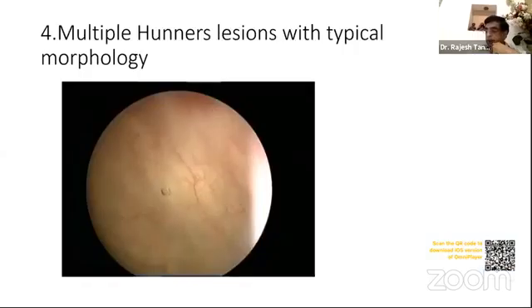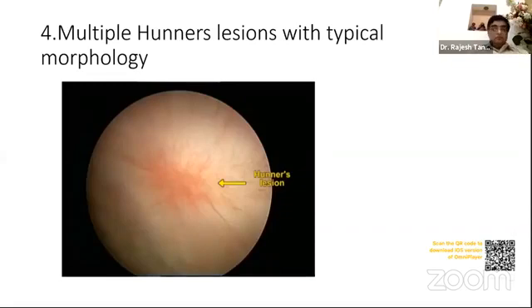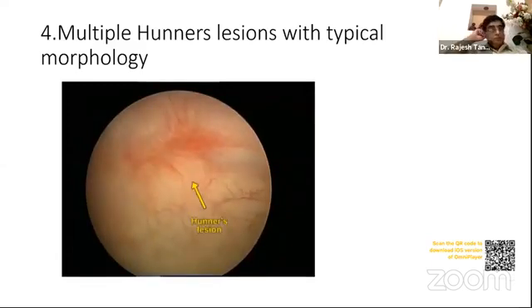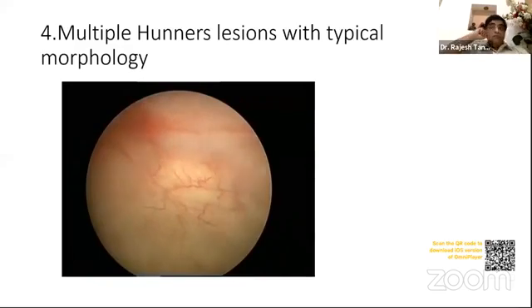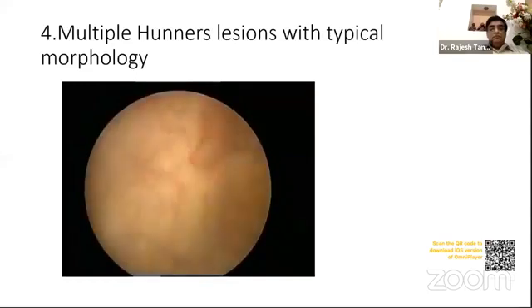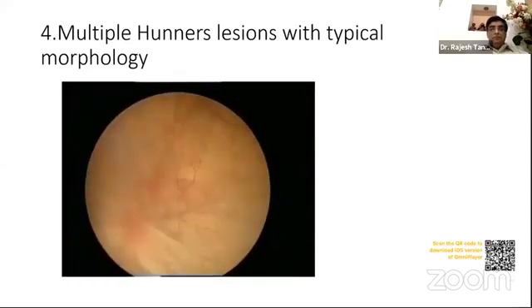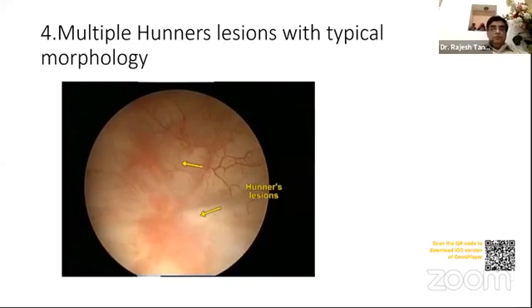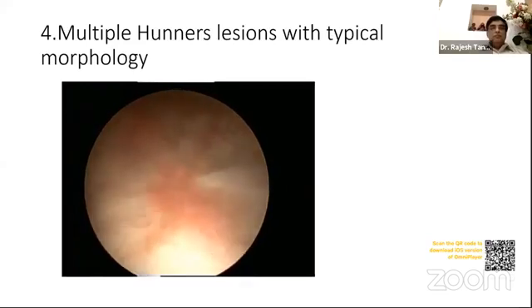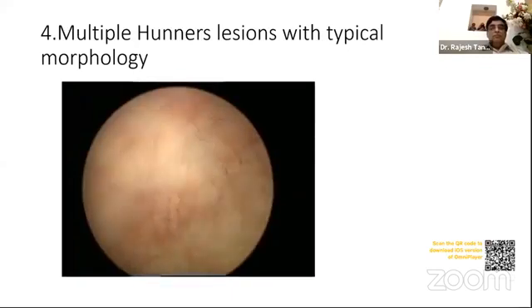This is a case of three years' duration. Note the characteristic morphology and multiplicity of Hunner's lesions. One lesion is close to the trigone on the right side. The cracking of the pale ischemic central zone upon hydrodistension is clearly visible.